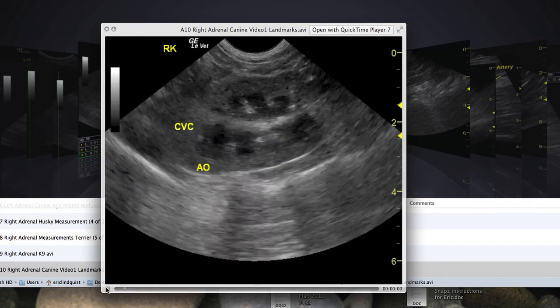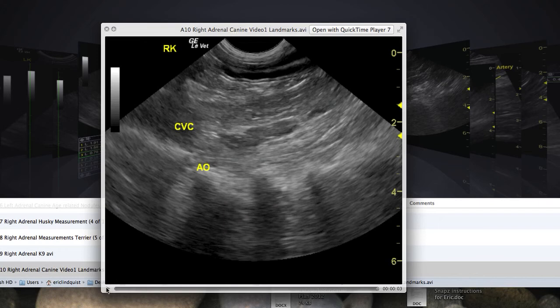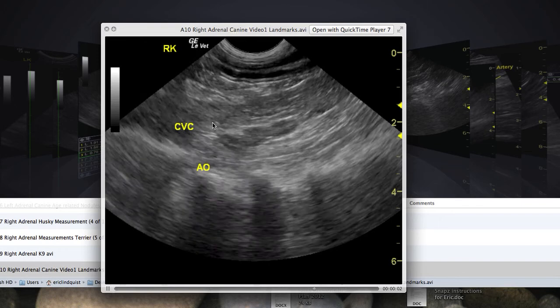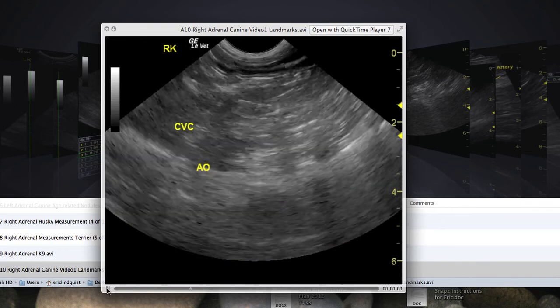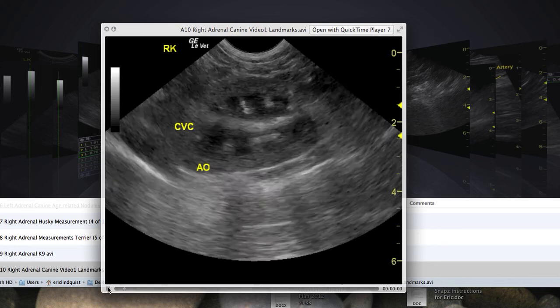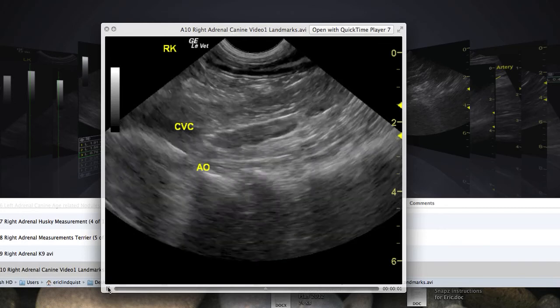To image the right adrenal, get the right kidney in a nice long axis, then drop the tail of the probe and push. This squeezes the vena cava but brings in the right adrenal gland. The key is a nice long, non-oblique right kidney — drop the tail and push gradually. You want the vena cava and aorta right side by side, and the right adrenal gland will be right in the middle, scanning at two centimeters. If you start obliquely, the right adrenal will be oblique and you'll only catch part of it. This is one of the most difficult maneuvers traditionally in veterinary medicine, but with practice it's very easy and should be part of a routine full abdominal sonogram.